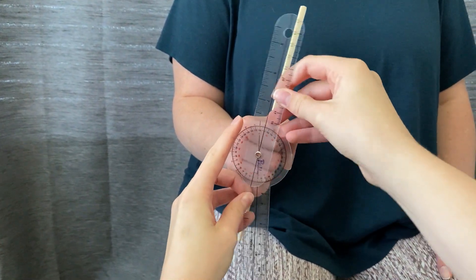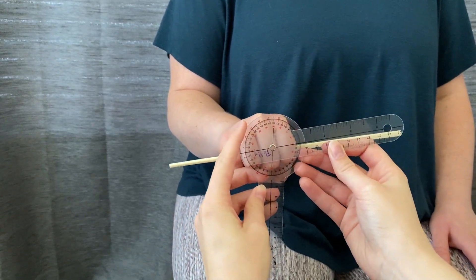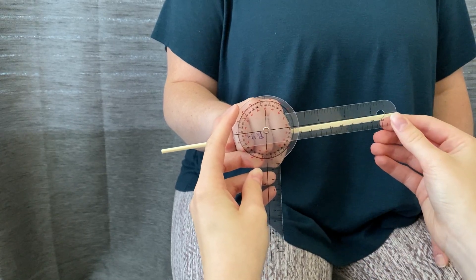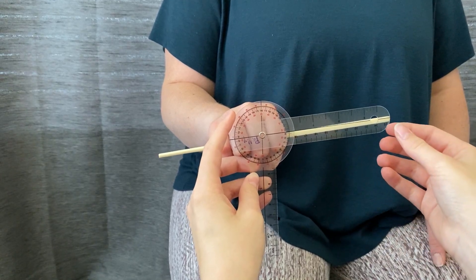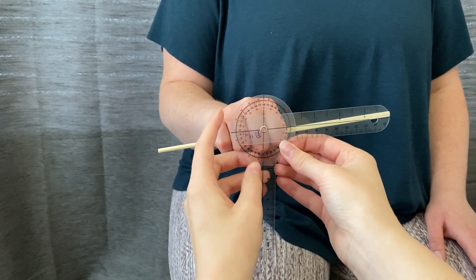So we'll go into pronation. Make sure you keep the stationary arm pointed perpendicular to the floor, and you want to make sure there's equal distance between the black line and the object being held. She is at 85 degrees.